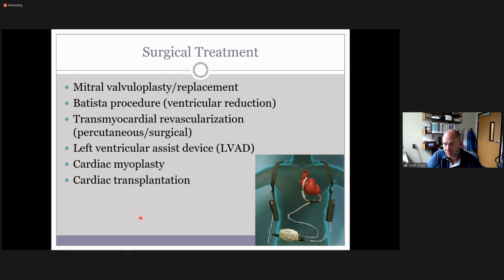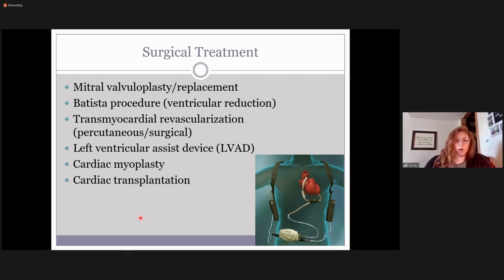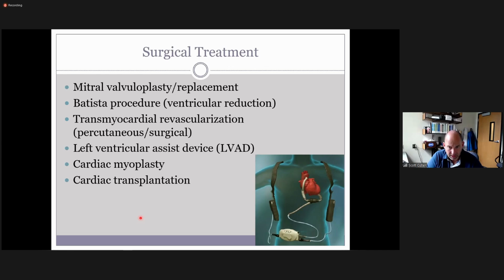Good, so let's go through it. Color Doppler, obviously we're putting color Doppler on the valves, looking for leaks in particular, and hemodynamic changes in our spectral Dopplers. What kind of hemodynamic changes do you think you might see with a dilated cardiomyopathy? Just slower? Yeah, so overall slower, which also means a smaller VTI, whether it's through the LVOT or the mitral valve. And the regurgitant findings are going to be an indication of the size and function as well.